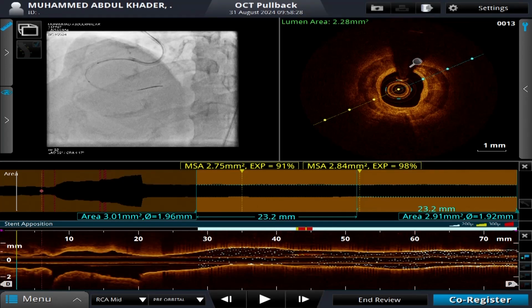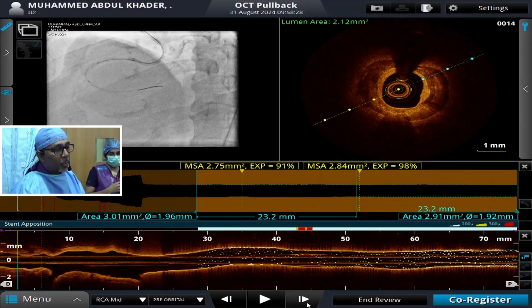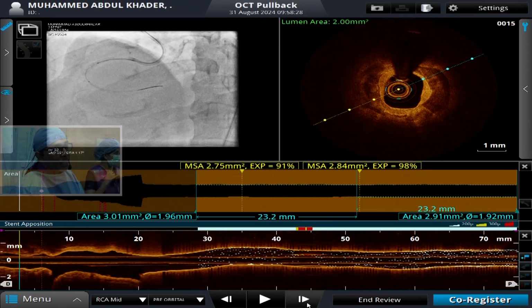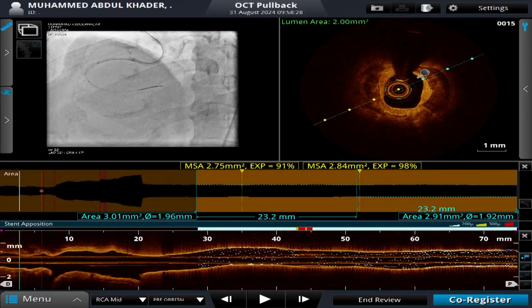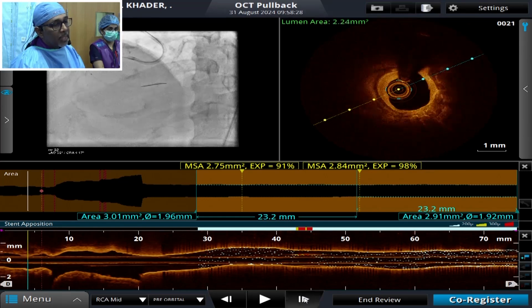What is reassuring is that at this particular area it appears to be thin, so following the lesion ablation, we hope that we'll be able to dilate it with a balloon and open it up, producing some cracks over there. In this area, between 1 o'clock and 6 o'clock you could see a thick calcification, but at 12 o'clock and 6 o'clock it's not so thick, which would certainly be helpful for us to break that calcification with a balloon.